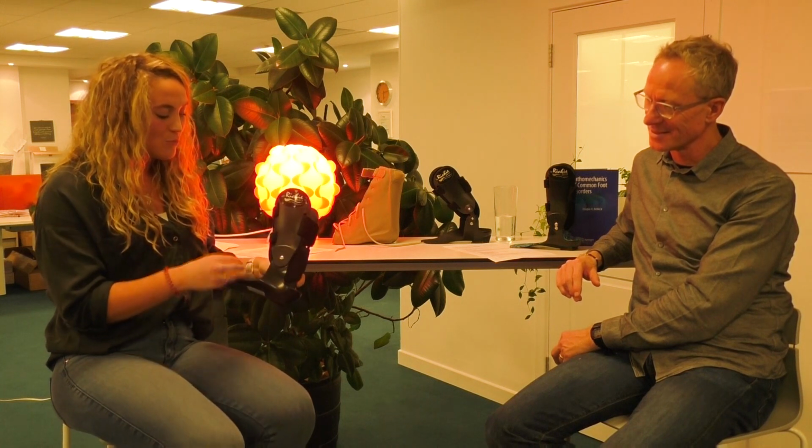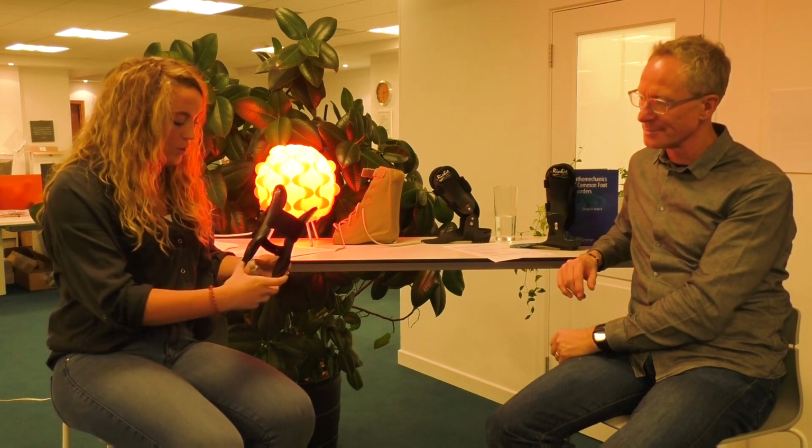I mean, the main reason behind using an AFO again is that it showed that it was the best at completely offloading the posterior tibialis tendon. It really just unloaded. It controlled the hind foot, so it reduced that valgus movement of the hind foot, and it's also taking care of those medial ligaments and preventing that MLA drop. So it really came from all angles and all the different aspects of adult acquired flat foot.